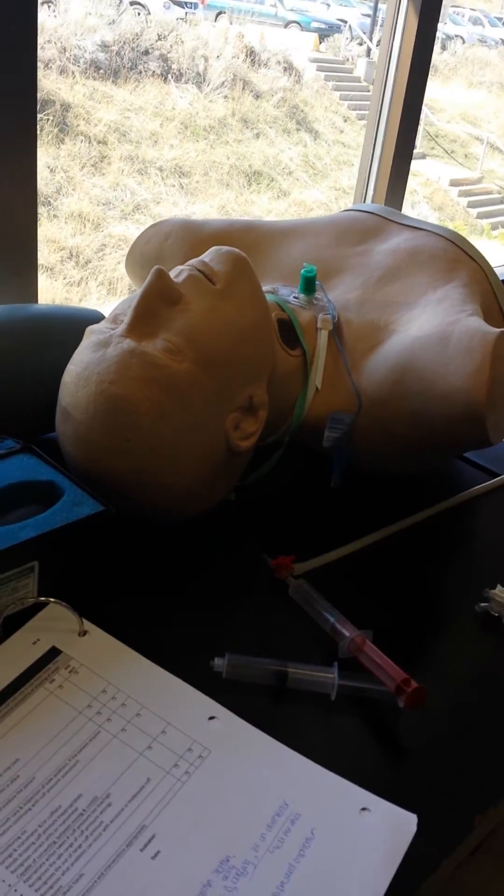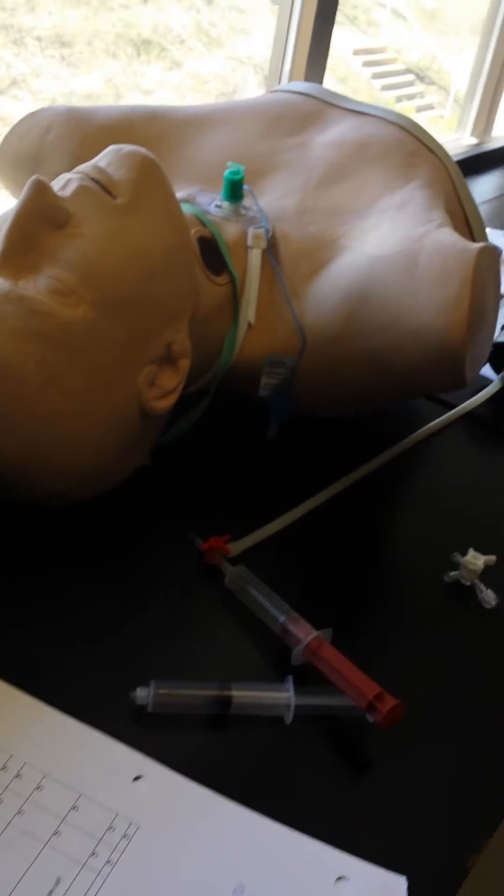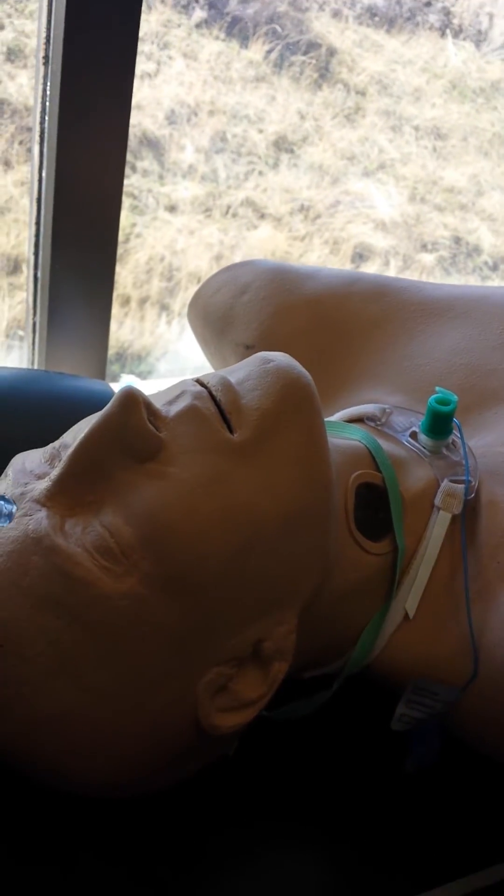So now for this one, you're going to have to introduce yourself to the patient. You're going to talk about the procedure, and then you're going to give them deep suctioning. But just talk about deep suctioning.